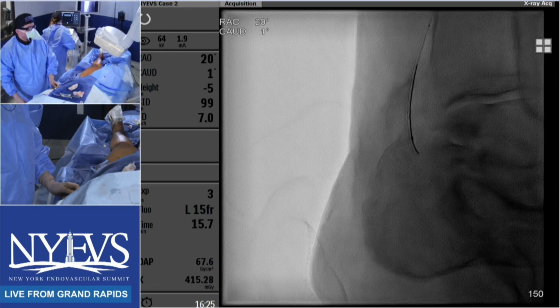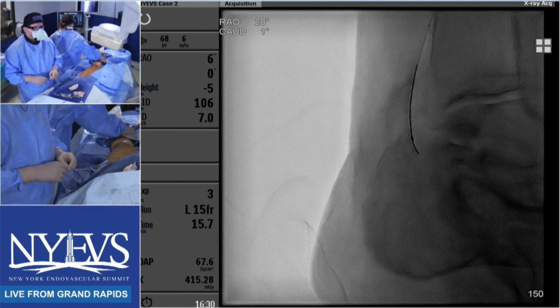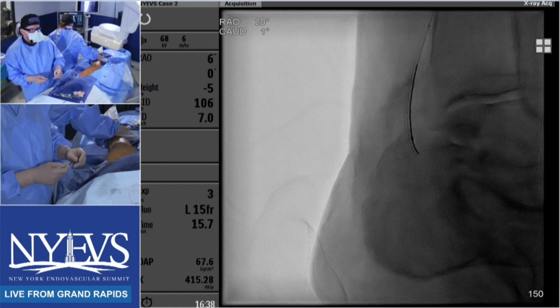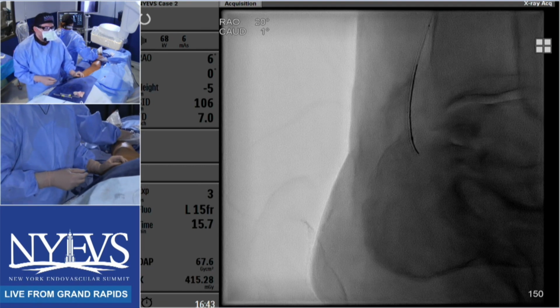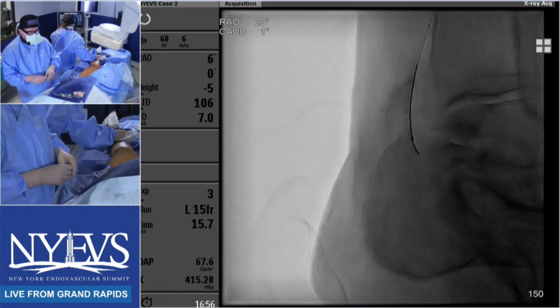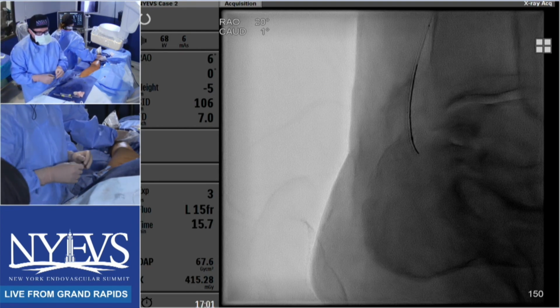Buddy, can you just talk us through that maneuver? That was a subtle maneuver you just did to try and facilitate the wire getting down past the common plantar. Can you talk to us about that? Yeah, so mechanically what Caitlin did is she actually dorsiflexed the foot, changing the angulation of that CTO. And Caitlin said, I can see where the tip of the balloon is going to be, and we can see where we need to go. There's a branch there. I need to go to where you actually see the artery. So I just switched from the 12 grams to a 40-gram tip wire.